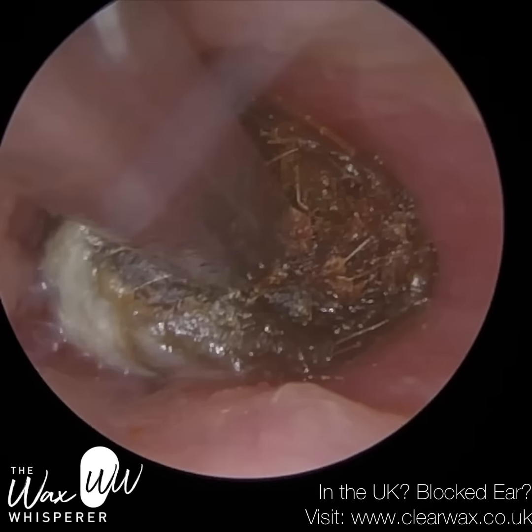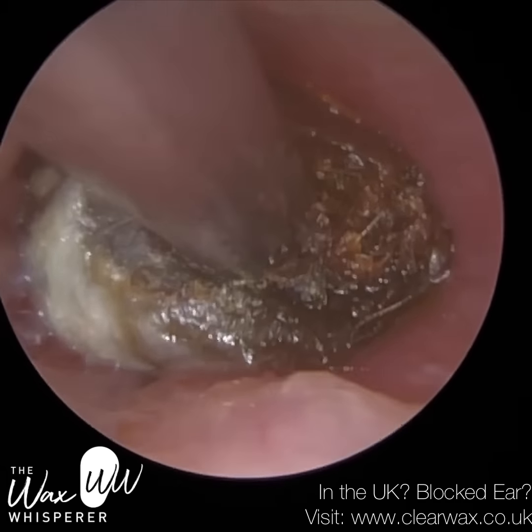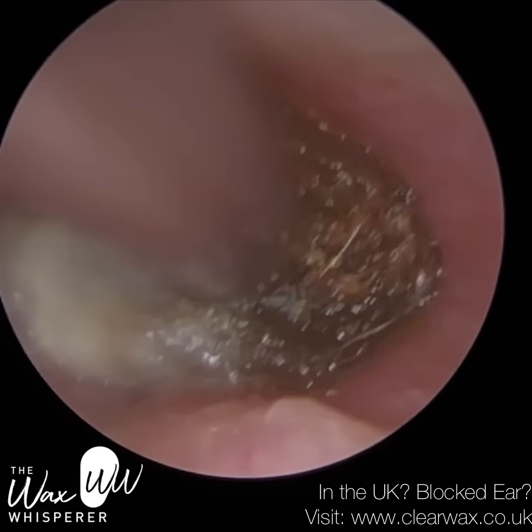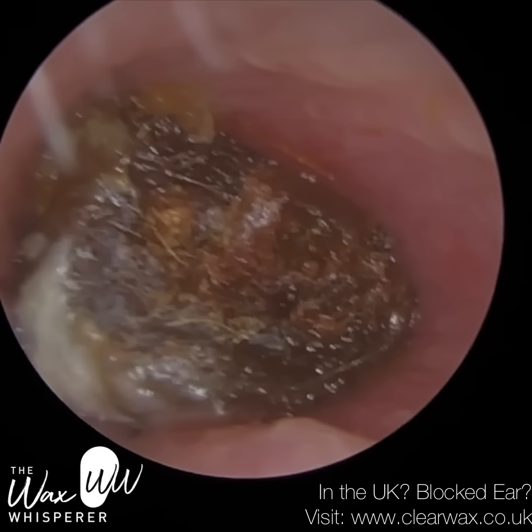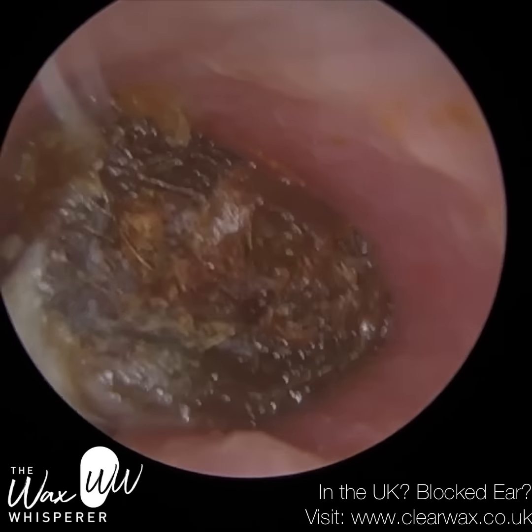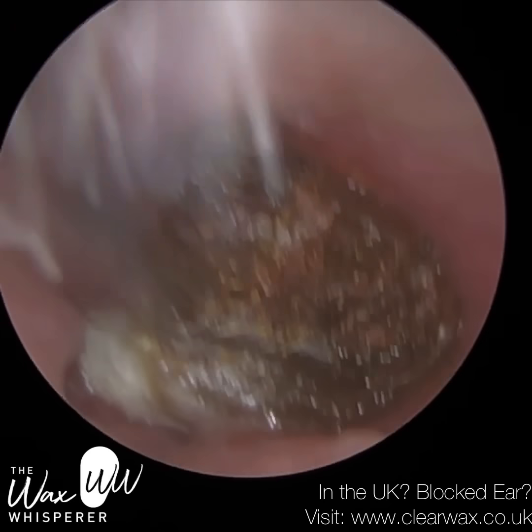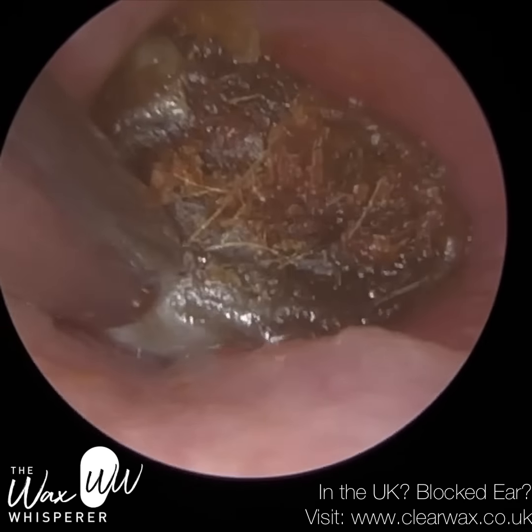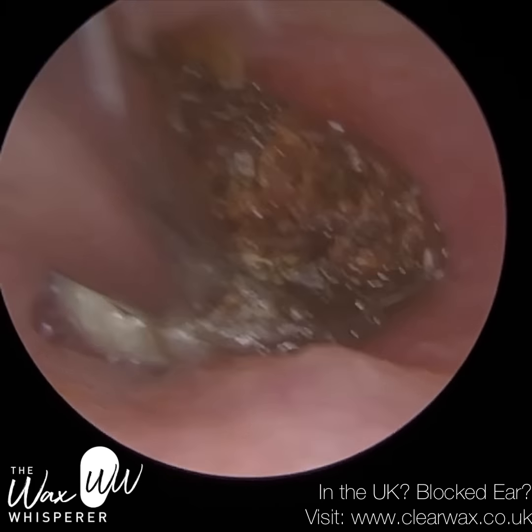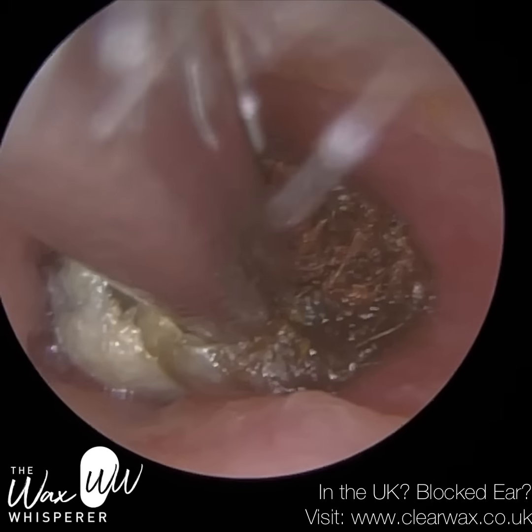Sometimes you read comments, oh, why don't you just get the hook in and do this and do that and remove it? Believe me, if that was your ear, you'll realise why we don't do that. It's the last thing we want to do, because it's painful for the patient. This is a real patient we're treating. It's not an ear model or mannequin. And if it was your own ear, you wouldn't want us, believe you me, to do what you're telling another specialist to do.